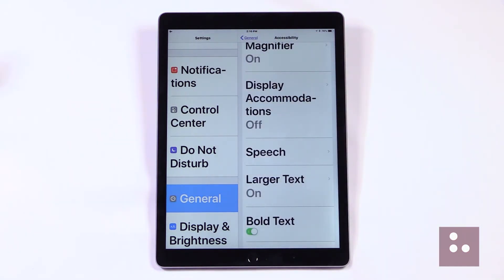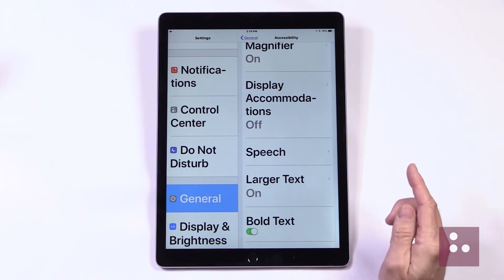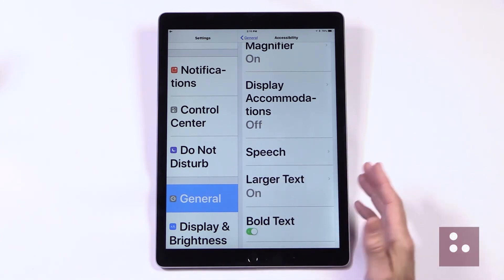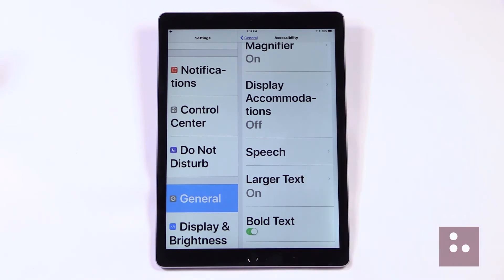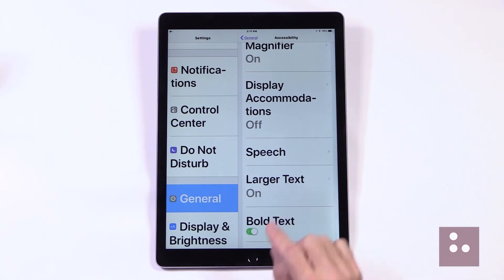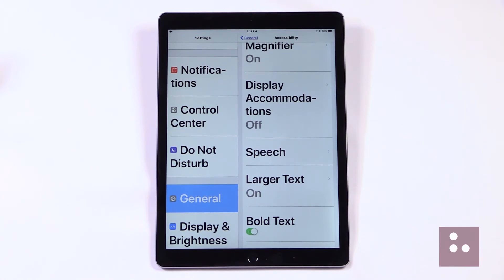The next item in our list really is my favorite low vision accessibility feature — this is our Large Text feature, or what Apple likes to call Dynamic Type. Dynamic Type is super handy and it's going to enlarge the text across all of our native apps, like our Calendar, our Mail, and as we can see, we can even enlarge our text right here in our Settings app. We have an iFocus video called Adjusting the Text Size — that's another iFocus video you're really going to want to check out.